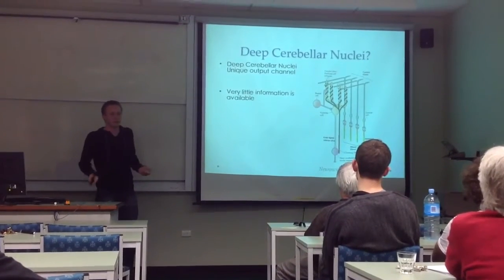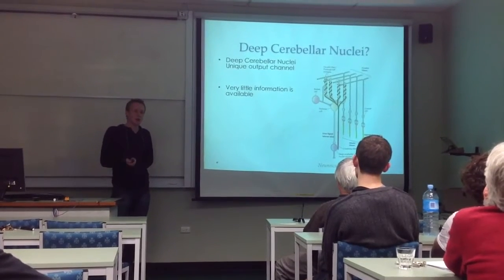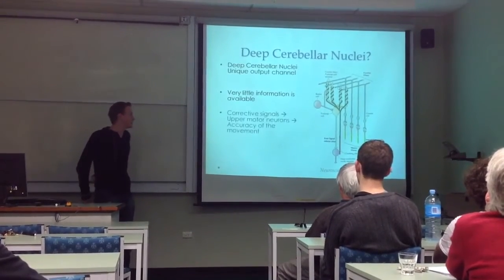The problem is very little information is known about it because it's so deep and so small. So MRI has the depth penetration required, but not the resolution to find out what's going on. So that's where OCT comes in.